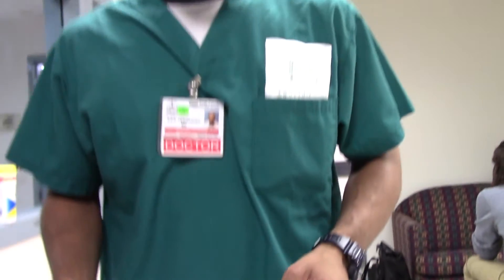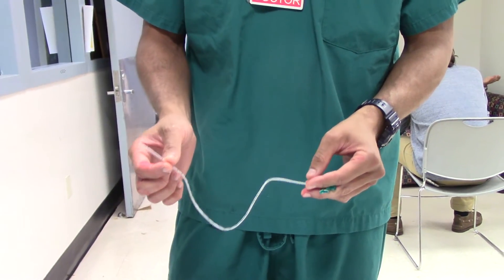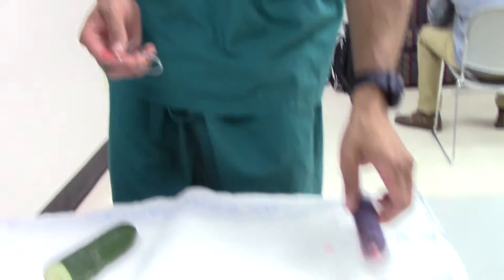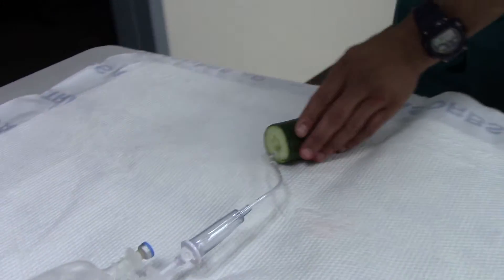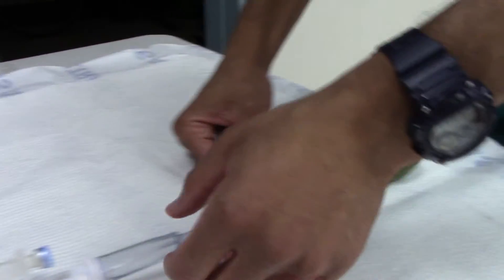Today we're going to do a retrograde urethrogram with a low-fidelity model of the anatomy. We have a small catheter — basically a baby feeding tube — and a 60cc syringe with red food coloring to make the flow more apparent. This IV tubing will simulate the penis and urethra leading up to our bladder.